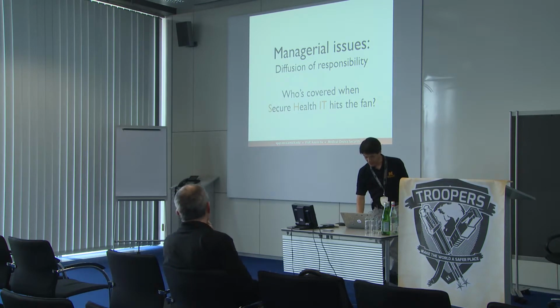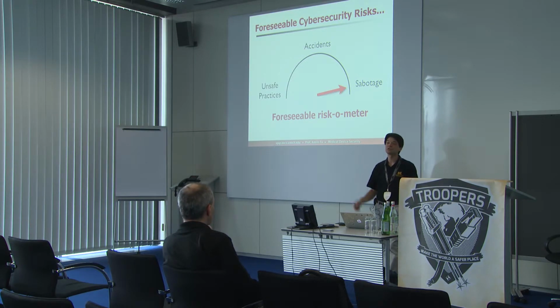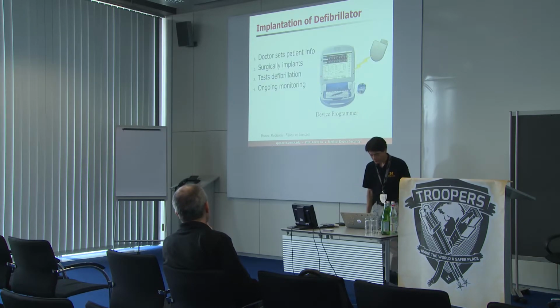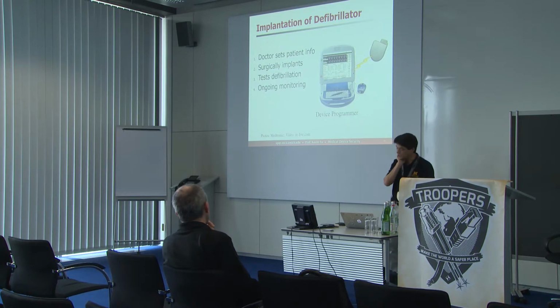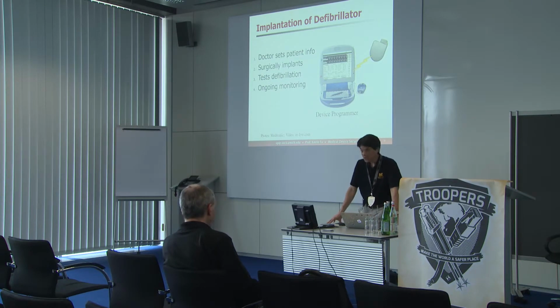But let's get into the security side now that I've seeded you a little bit with the safety stories. Now you can begin to understand, oh, this is why people don't like me when I come to them with security issues. So let's think about the world of sabotage for a moment. Back in 2007, 2008, we did this analysis of a defibrillator, and we wanted to know how secure it was because it was using some kind of wireless communication. So I studied this by going into the operating room and seeing a number of patients getting the implantations to just learn the workflow and how things work.